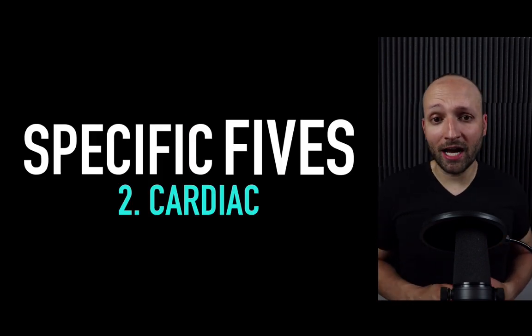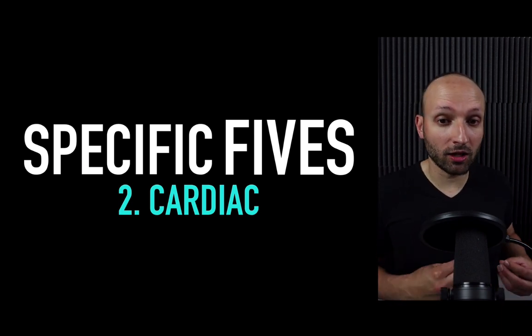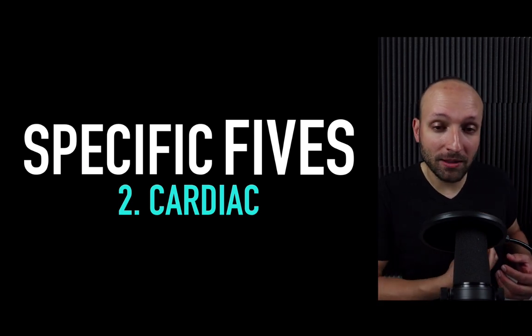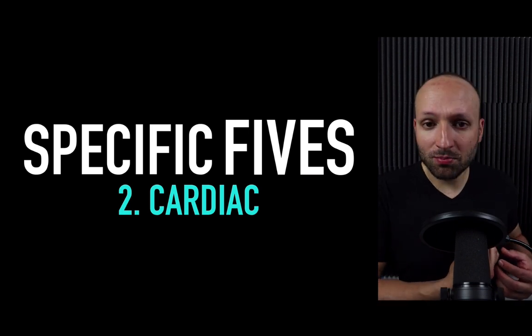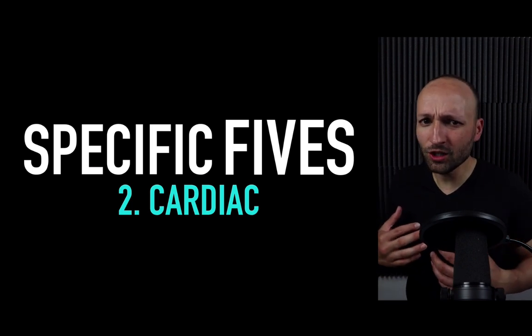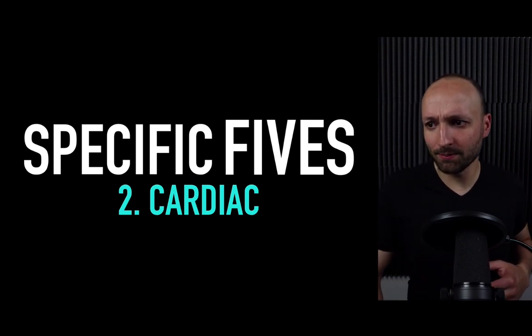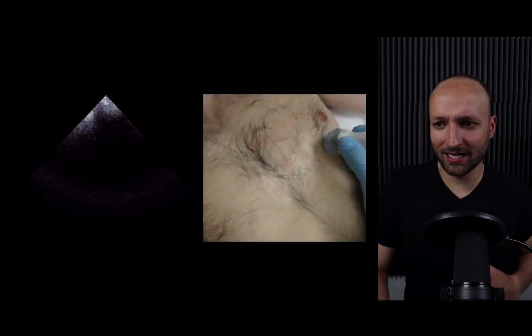Now, with regards to cardiac, this is where a lot of people struggle because it's kind of difficult. We talked about a lot of them already, which is kind of big movements and then small movements to kind of do your coarse tuning or fine tuning of the microscope. You can have the patient move over to the left lateral decubitus as well. Those are some big tips, but let's go through a few more specific examples.